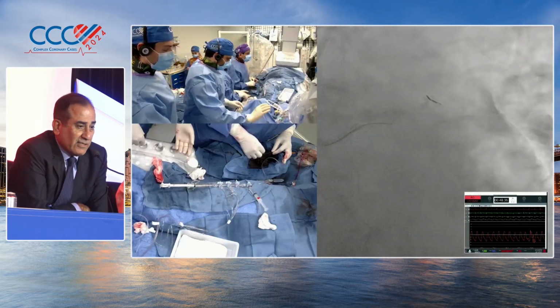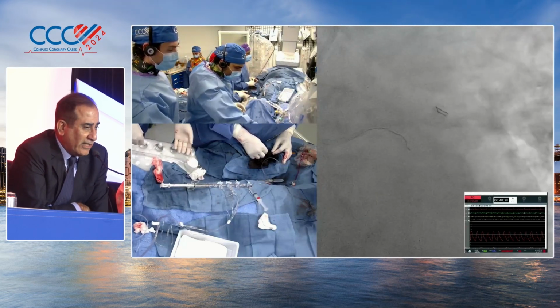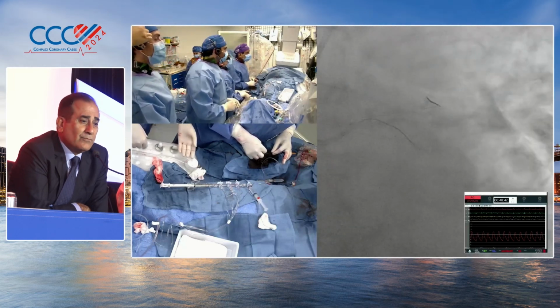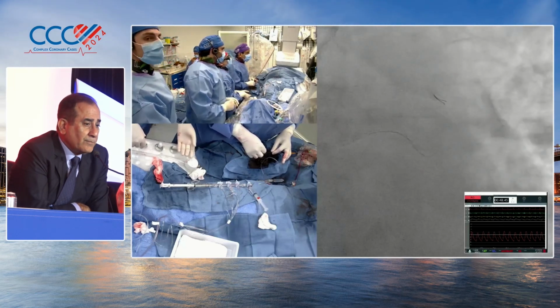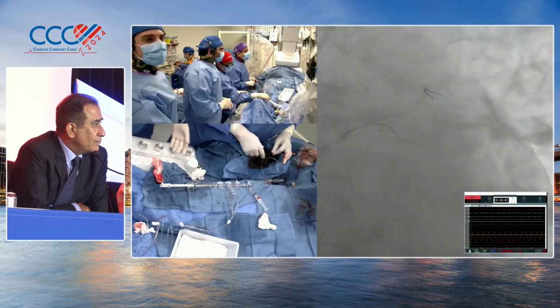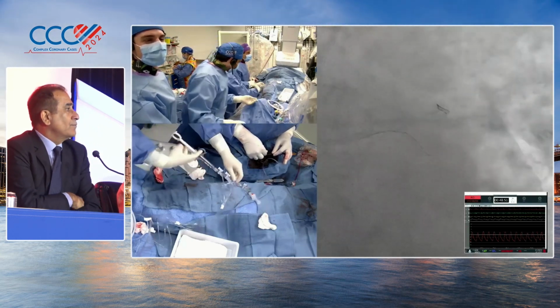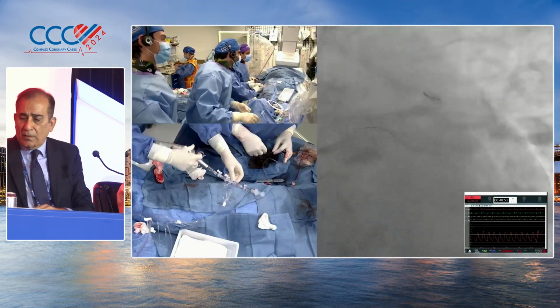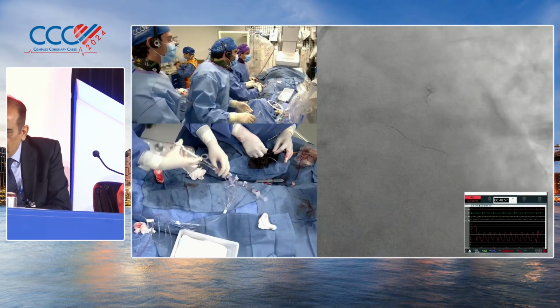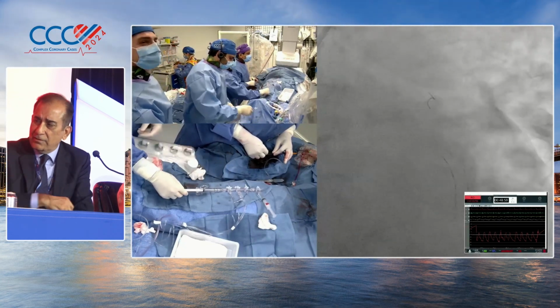So very nice result. Samin, any precautions you take when doing IVL of the left main? Yeah, so we talked about it many times. If the patient becomes hypotensive, just do 5 pulses as we have done in our live webcast also. So maybe just 5 pulses. Doesn't have to do 10. And of course, give a gap, we call it breathing room, before you continue further.